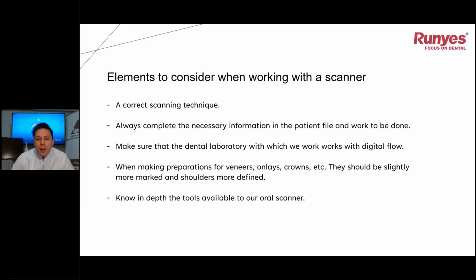If we don't mark the scanner's job, if we don't mark the tooth that we want to do a crown, a veneer or an inlay on, and the adjacent teeth, remember that the more information we provide to our scanner, the better job it is going to do. Because it knows where to scan if we tell it which tooth we want to work with. So the information it needs will be better if we provide the proper information that the software requires.